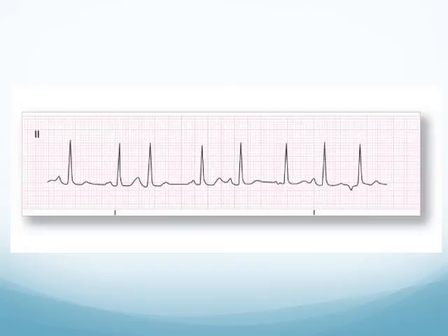We do have a QRS attached to every P wave. We may even have 4 P wave morphologies if you look at that very last beat. So this tells us, when we're using our cheat sheet, we have an irregularly irregular rhythm with a rate of 80. We have 4 different P wave morphologies with a QRS attached to each P wave. So we're able to say pretty certainly that this is a wandering atrial pacemaker.